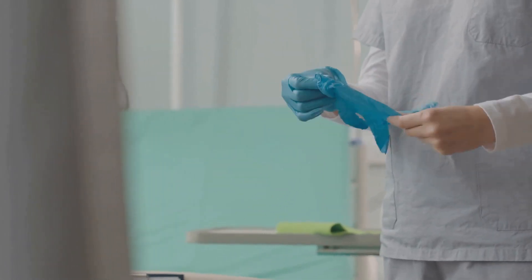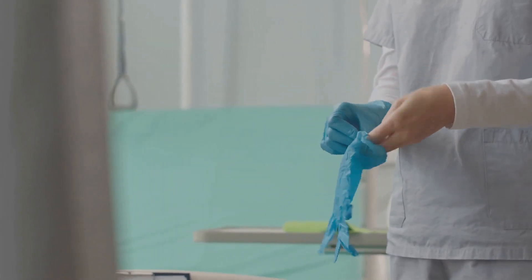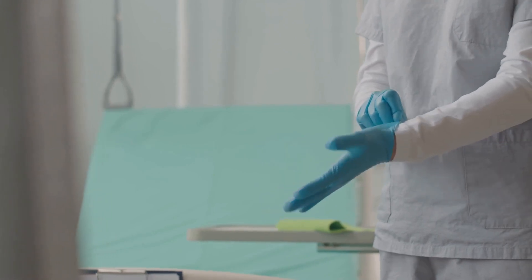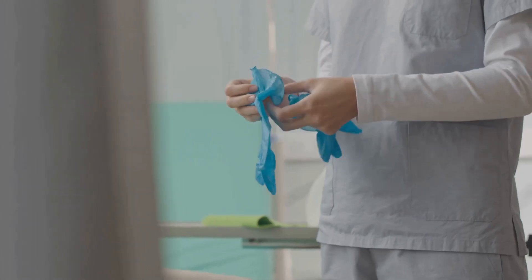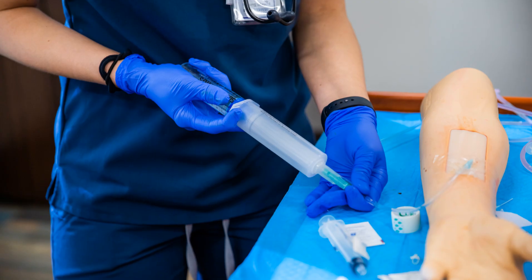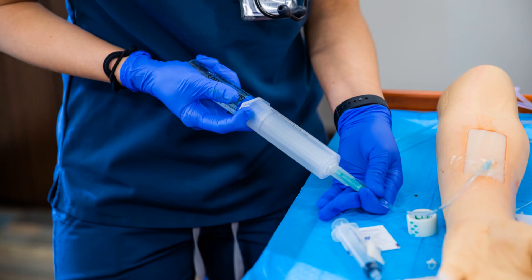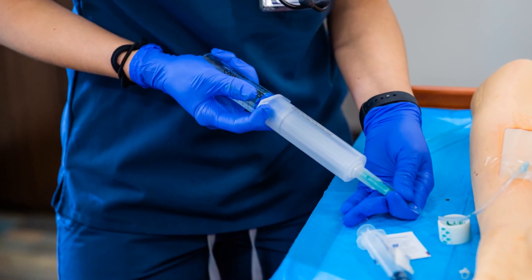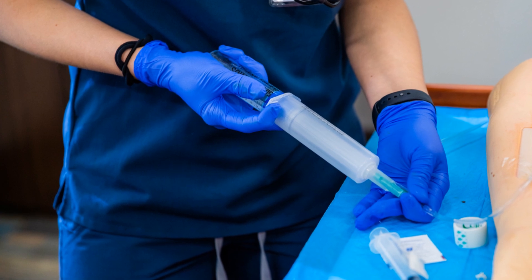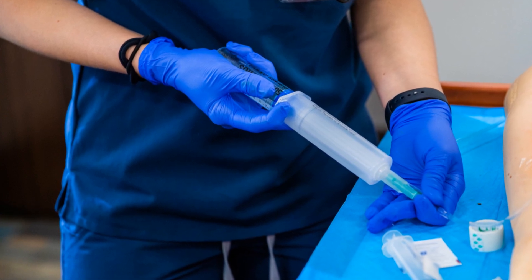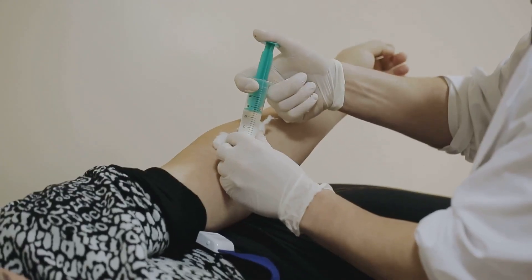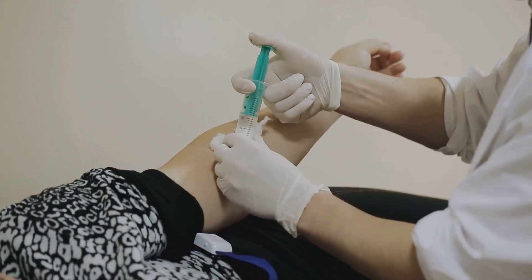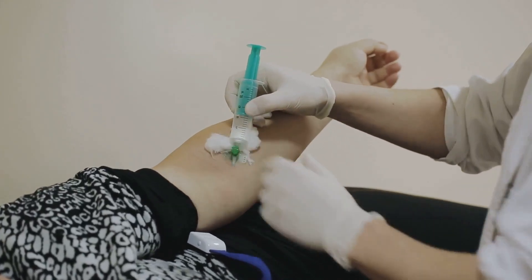Okay, time to put those skills into action. Whether you're a beginner or just brushing up, this step-by-step guide will help you master IV cannulation with confidence. Cannulation might seem tricky at first, but with practice you'll be a pro in no time. Remember, every expert started as a novice, so don't worry if it feels overwhelming at first. Let's break down the process into easy-to-follow steps, so you can approach each attempt with clarity and calm.